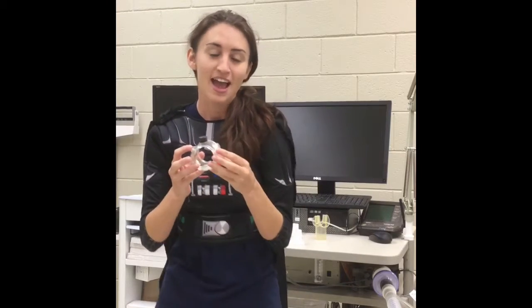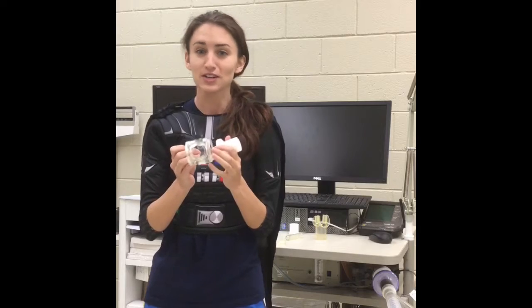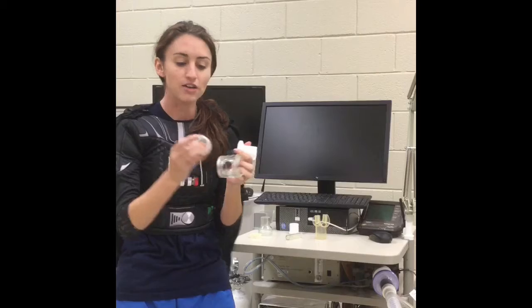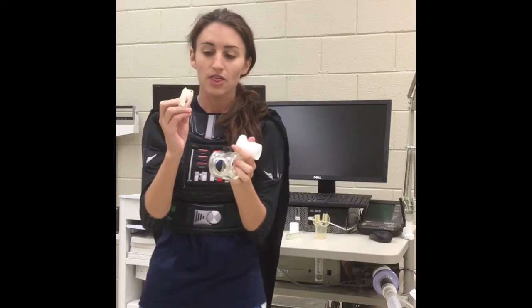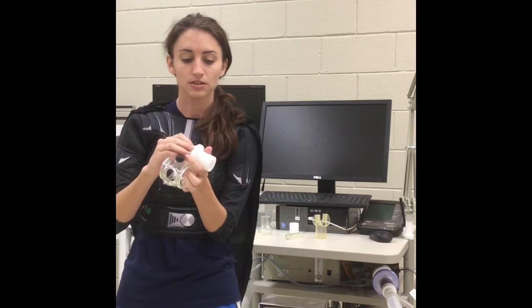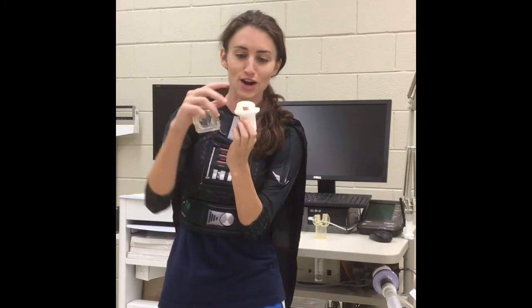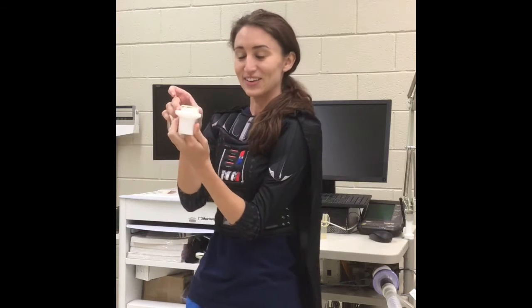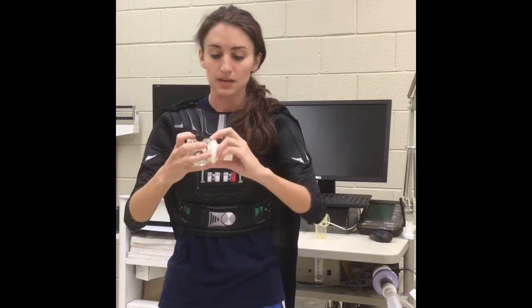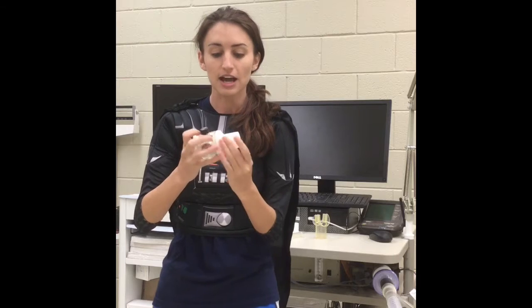First we have the main piece, and we are going to attach other pieces to this to make the Hans-Rudolph two-way valve. You have a little diaphragm, and you want to make sure that air will be flowing in through the white piece. Attach it so that if you press it with your finger, it goes in. Then put it on the main piece, making sure it is tight but not too tight.